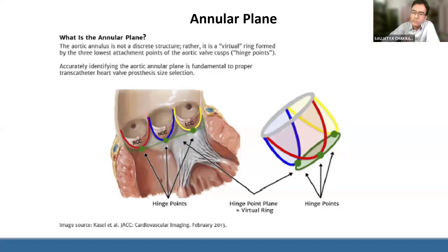That is possible with the software, that you can actually decide which part of systole you want, which image you want to analyze. And if you find it's too artifactual, as you keep doing and analyzing the CTs, you actually learn which is better. But the part of acquisition itself was a great education.